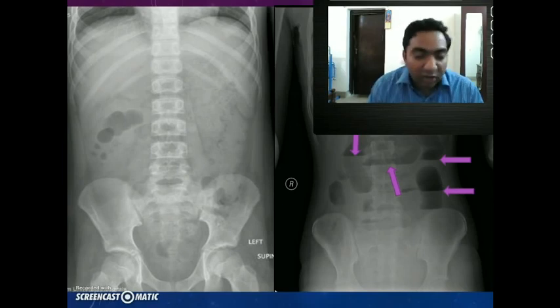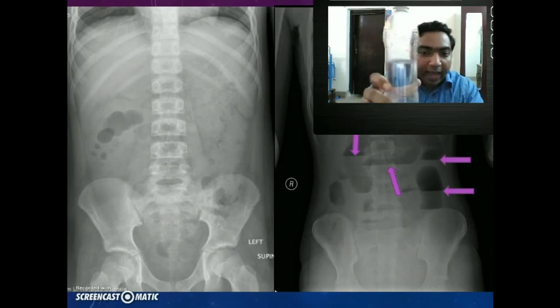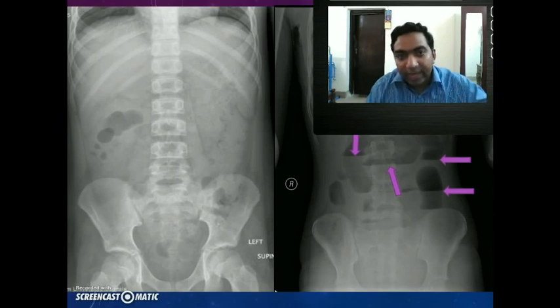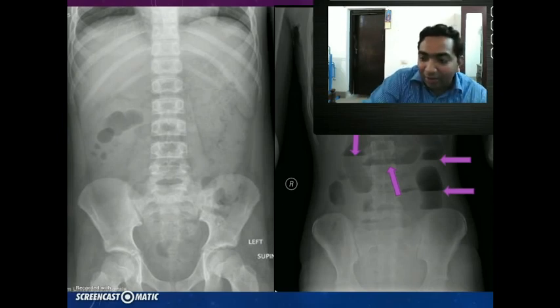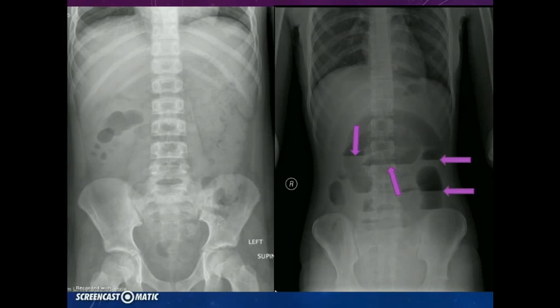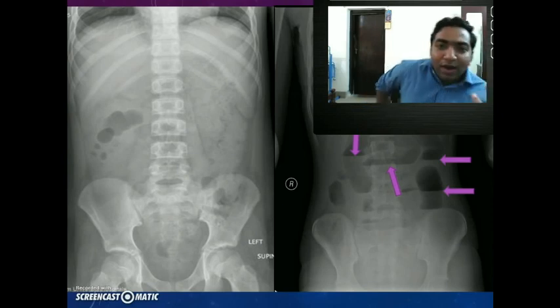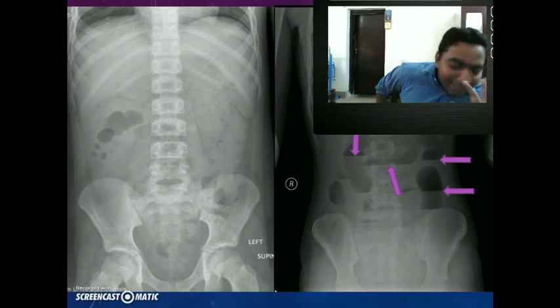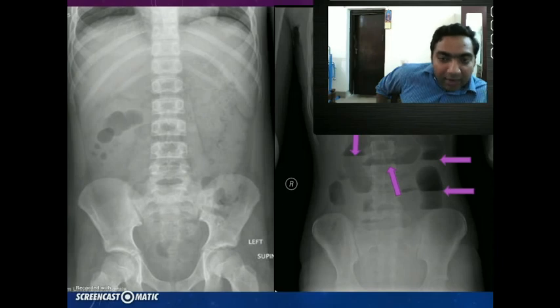In case of intestinal obstruction there will be stasis. When there is stasis, the bowel will go into ileus and there will be an air fluid level. Please note that ileus has nothing to do with the ileum — it means a lack of peristalsis in the bowel. So whenever there is stasis in the bowel, there are air fluid levels.